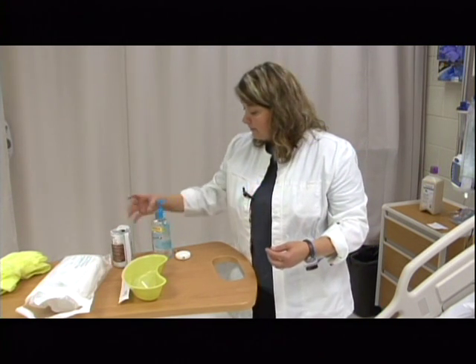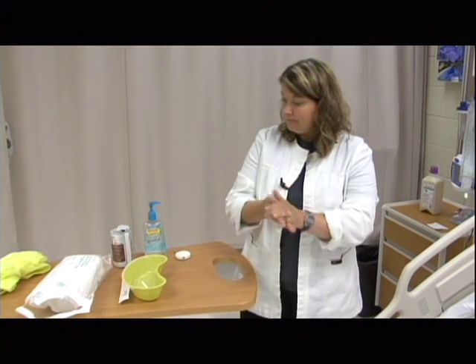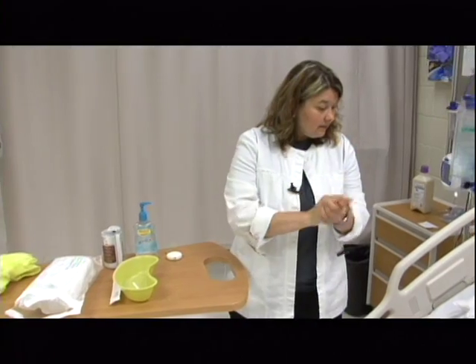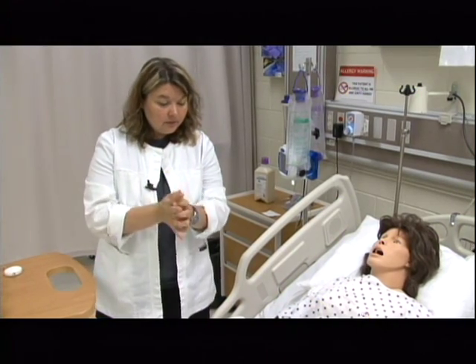I'm going to go ahead and refoam my hands here before I get started. I'm going to again ask Miss Smith if she has any questions or concerns before we begin, and she says she's okay. She says she's not having any pain. She's not sick to her stomach.